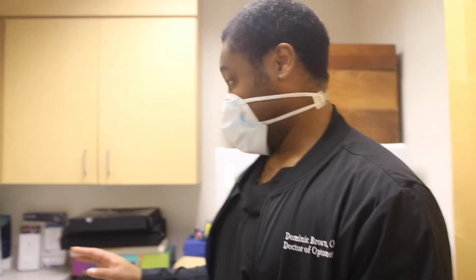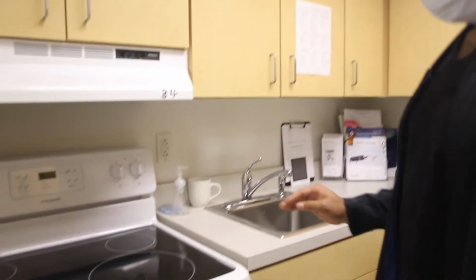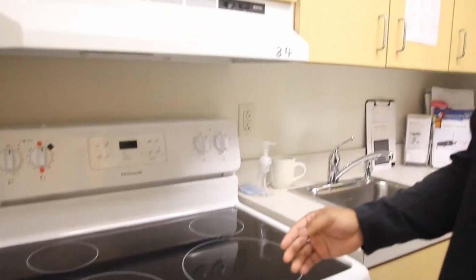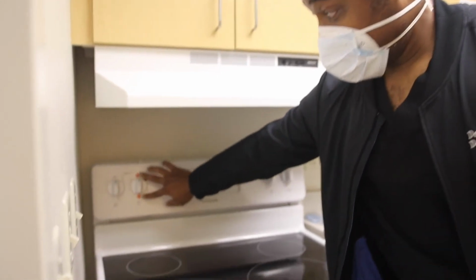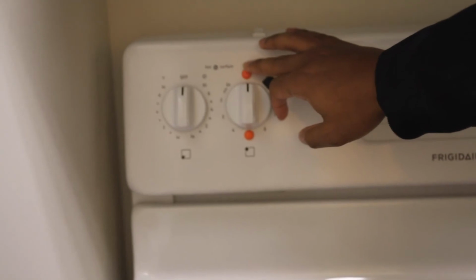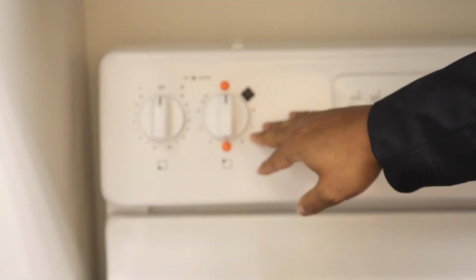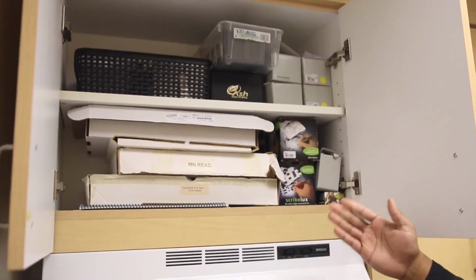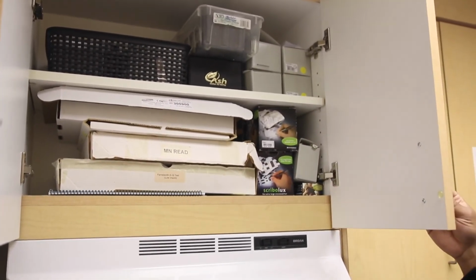So this is a room that we also use to help rehabilitate patients with their visual goals. It is staged like a kitchen, therefore we're able to simulate their home environment with the low vision devices. Sometimes you need non-optical devices to help them with their goals, such as bump dots here. So versus patients actually resolving acuity and seeing, they can use tactile cues in order to feel where they need to go. In this instance, we want them to be able to cook safely, so we use dots so they know what settings they primarily use. We house a lot of our low vision devices here. So here's some charts that would test for contrast and some other reading types of functional acuities.